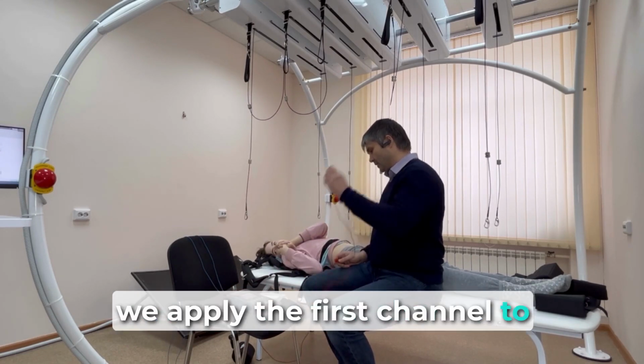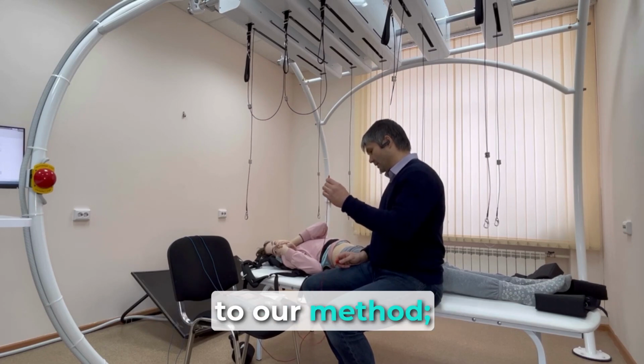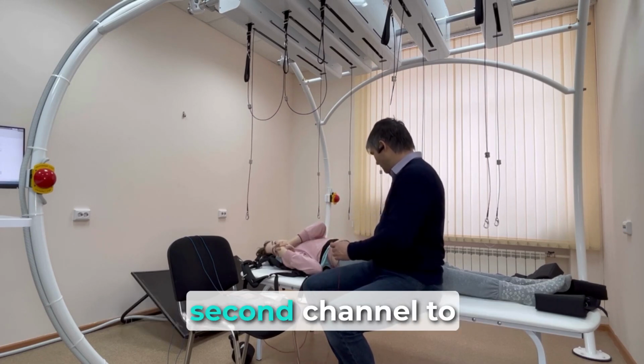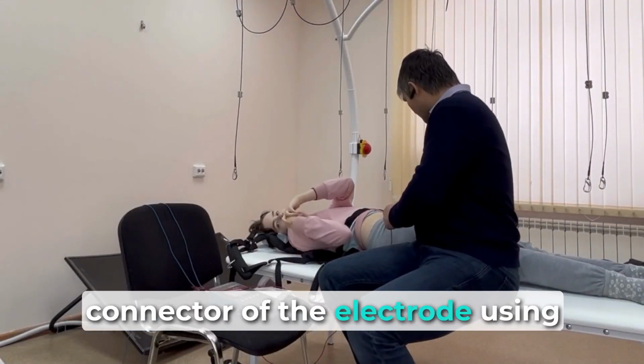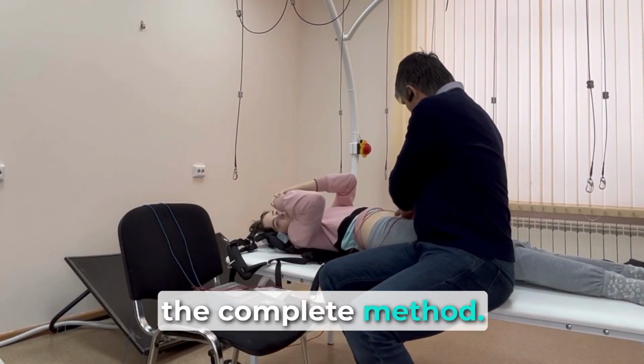In this case, we apply the first channel to the left side according to our method. We apply the red wire of the second channel to the right side. We attach it to the push-button connector of the electrode.